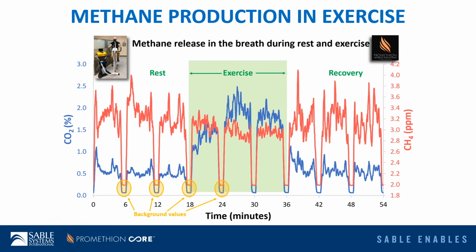But then he began to exercise on a cycle ergometer for about 20 minutes, and again, as you might predict, his CO2 levels increased substantially, here by 4-fold. But his methane losses, however, seem to have decreased slightly during exercise before returning to those normal levels during the recovery period.